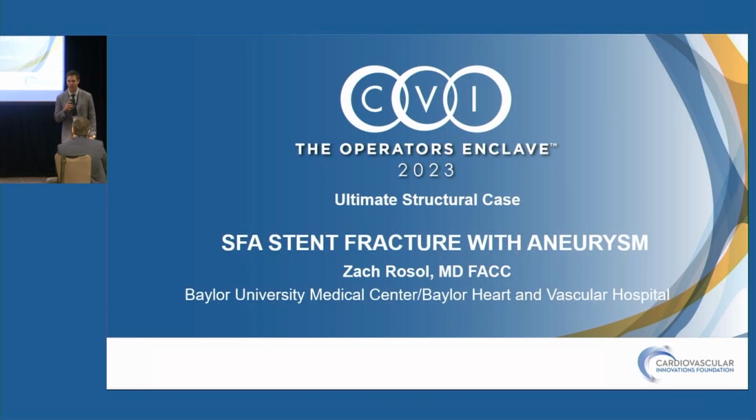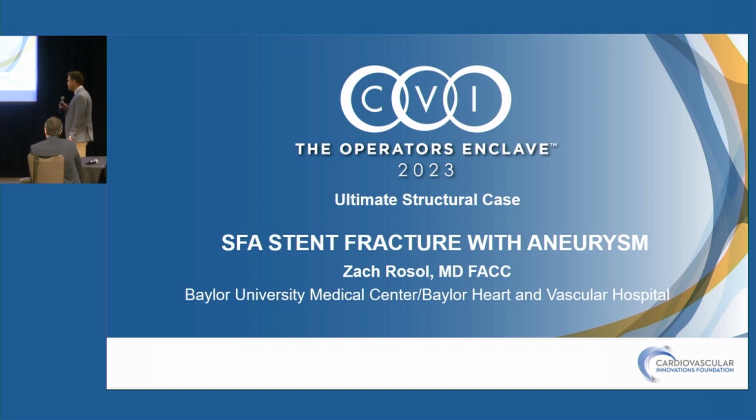Yes, as Subhash said, I'm in Dallas, downtown at Baylor Heart and Vascular Hospital. I'm lucky to call him my partner. So we're going to talk about an interesting case here of a stent fracture. While technically it may not be the most interesting or most challenging, I think intellectually it's really important, brings out some good teaching points, and that's what I'm going to try to highlight as we go through this.